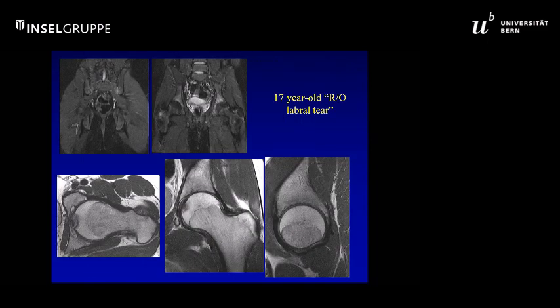Again, don't forget this kind of thing is a 17-year-old rule-out labral tear, markedly thin cartilage, but you also notice there's a bone marrow edema pattern by the SI joints and in the acetabulae, and this is a seronegative spondyloarthropathy. So we always want to think outside the box.